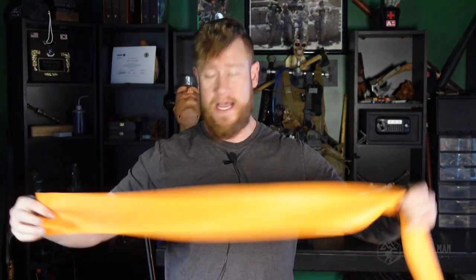Welcome back to the Mountain Man Medical YouTube channel. In today's video, we're going to be talking about how to apply the SWAT-T. This is one of my favorite things on the YouTube channel. If you've been around for a little bit of time, you're going to know that I'm a gigantic fanboy for the SWAT-T. It has a lot of different uses, but I realized I didn't have any videos on how to apply it.